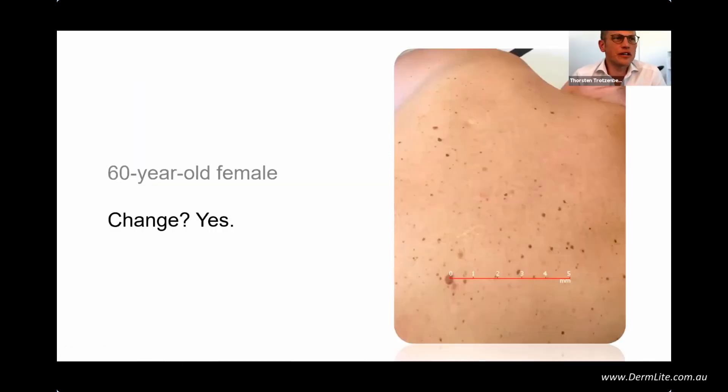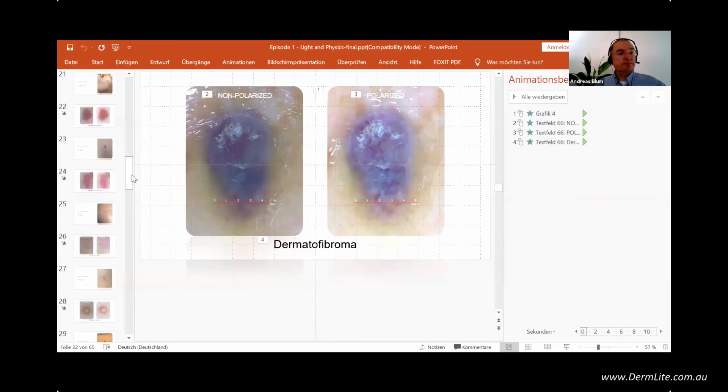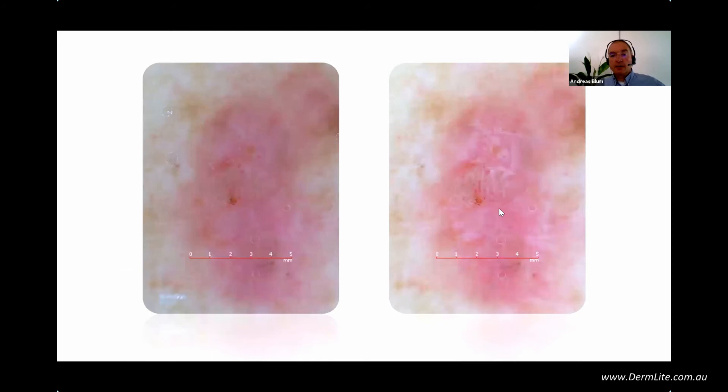There's a question about where the white lines are on the BCC. Going back to that image — here you see the white lines. When you compare and toggle between non-polarization and polarization, you can see the white lines appearing and disappearing. This is a very good trick when you do your examination — I'll show you later. The white lines appear with polarization and disappear with non-polarization.